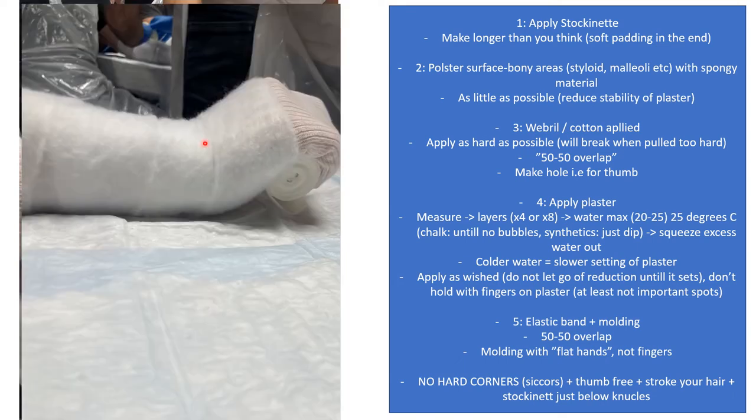Then you make the patient hold this. Here, you are molding it so that it's in, like Arun Sayal would say, dorsiflexion, because the fracture is going up here. You want to push it down, and it wants to go up again. And actually, they're molding it in the wrong way, right? They should mold it downwards, so that you're pushing against the way that the fragment wants to go. But anyway, tradition is tradition.